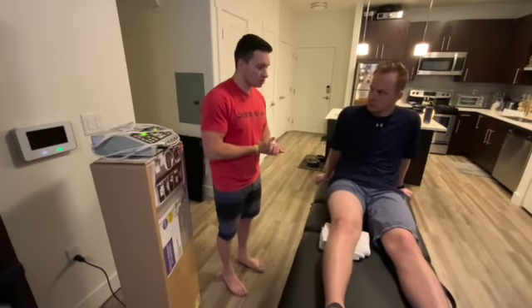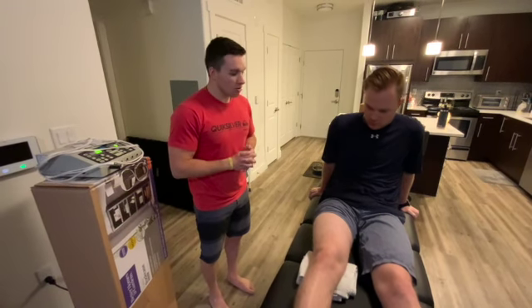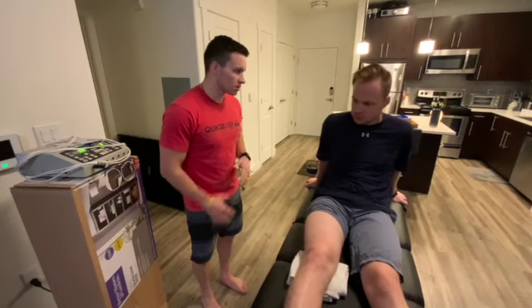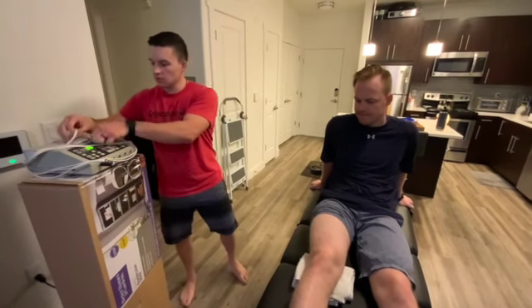Before we get started, have you had any cancers or anything like that around your knee? Okay, and then also, do you have a pacemaker or anything like that at all? It does not necessarily matter where it's on your knee, but I just like to make sure, because some people get freaked out about it. Okay, so what I'll do is I will get all these pads set up on you here.